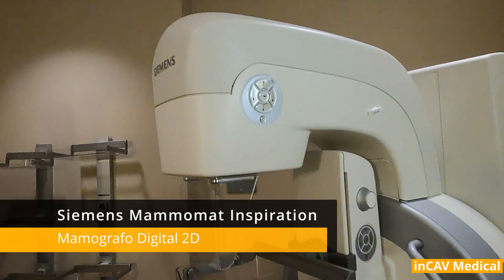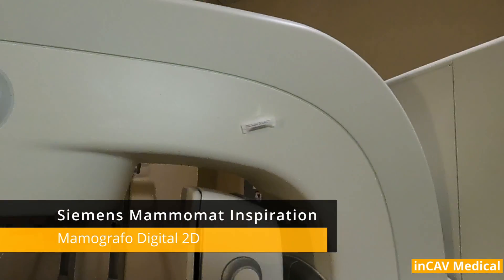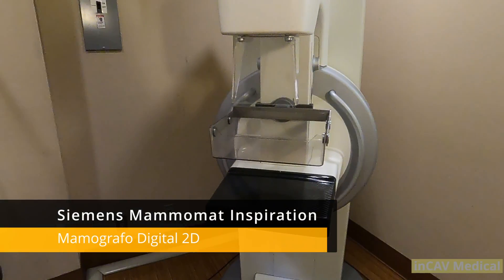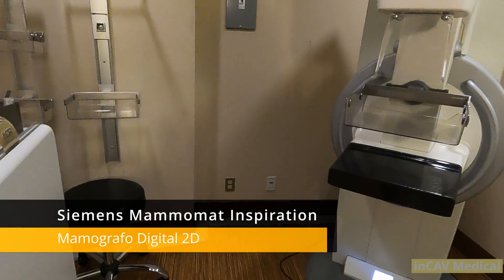Hi, today we are going to see the Siemens MammoMat Inspiration 2D MammoUnity High Definition. First we are going to see all the controls, how to move the gantry and the paddles.